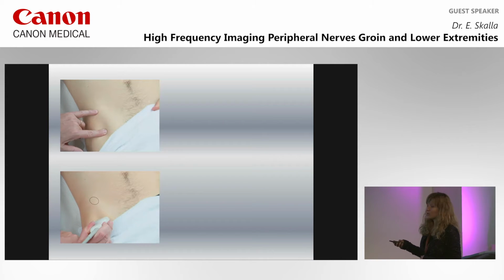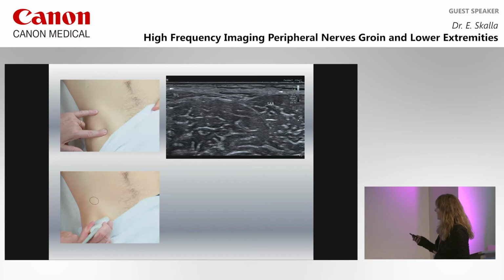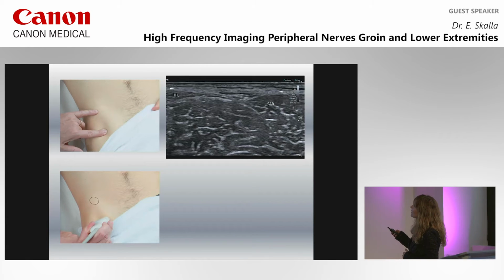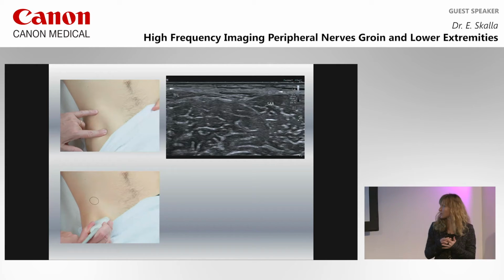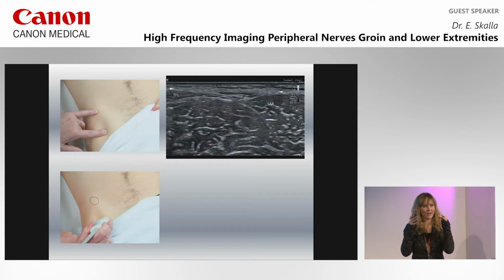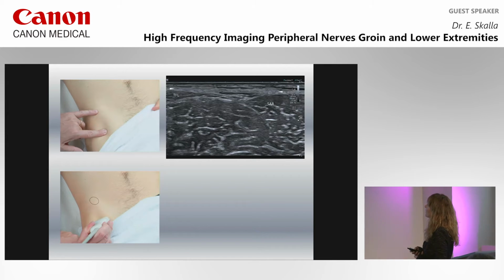Usually you would search for meralgia in this region, but you search for the nerve first here. Then you get this picture. The Sartorius muscle is our internal landmark. The other one is the tensor fasciae latae, a flat muscle. This is the rectus femoris. Now you can see this fat-filled flat channel. Subcutaneous nerves often run in such fat-filled flat channels, and this is a very prominent one.